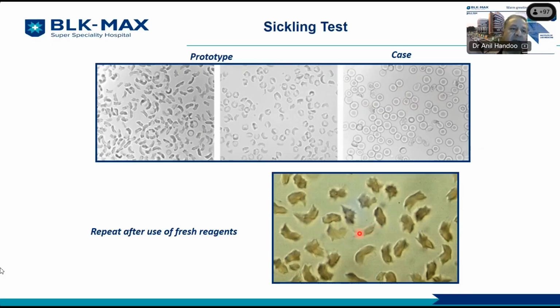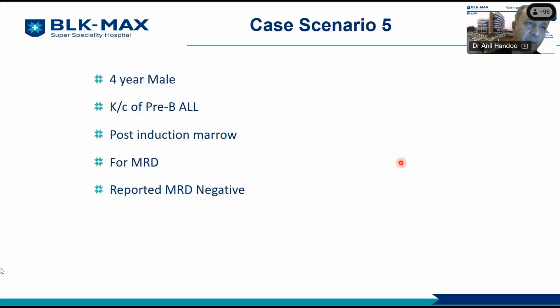So in this case, if you notice, the reagents had kind of given up, and they were not conforming to what was expected out of them. And thus, the reagent itself was an issue while doing this test.